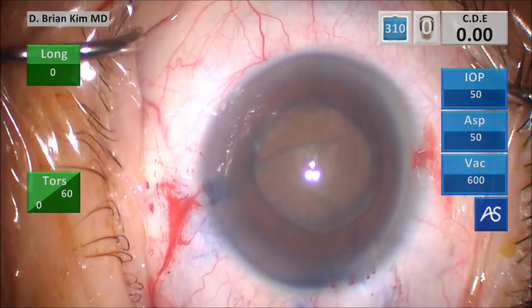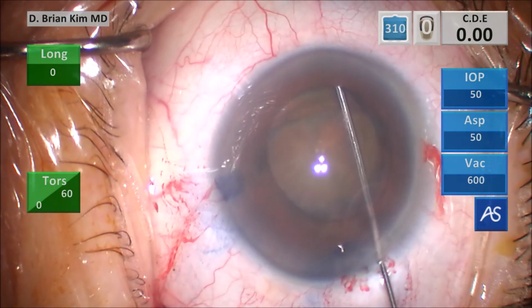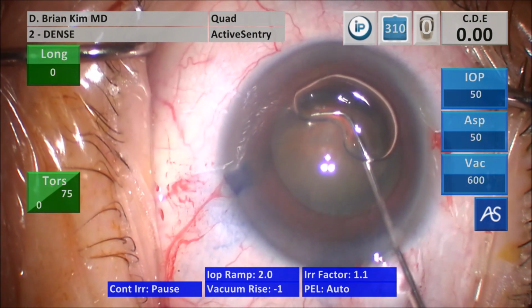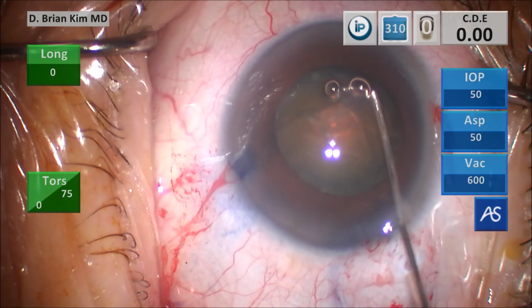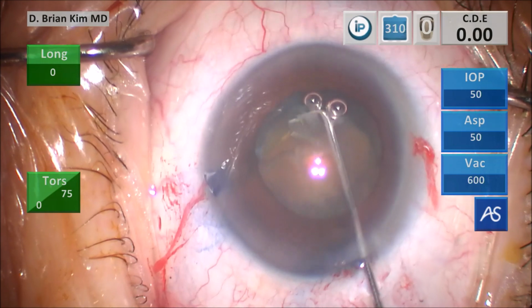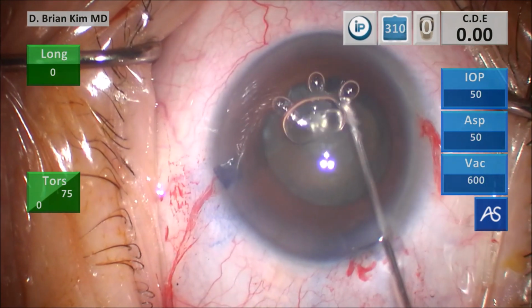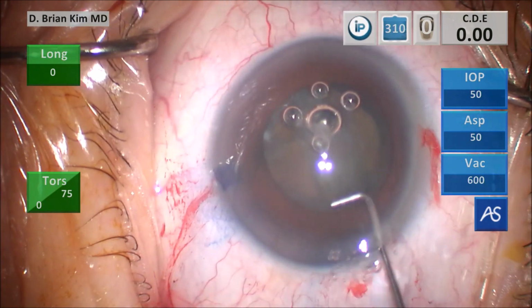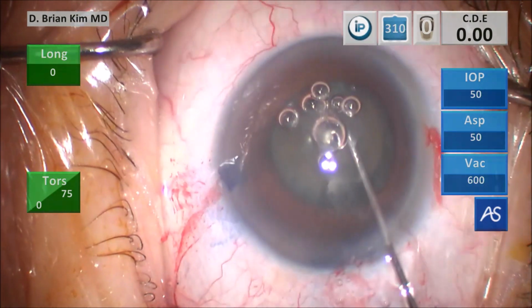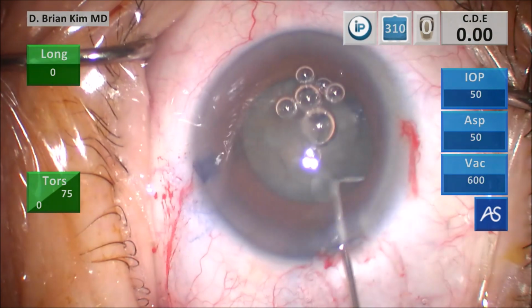And this is the capsule fornix hydrodissection technique. I place a cannula under the rhexis edge contra-incisionally, point the tip down. Oh, you see a big air bubble goes into the capsule bag. So then I sucked some of that air out, lift the lens up, a lot more bubbles come out. And unfortunately, sometimes you can get some bubbles in the cannula. I'm sweeping around and you can see the lens is beginning to spin now. And I'm going to remove some of those bubbles.